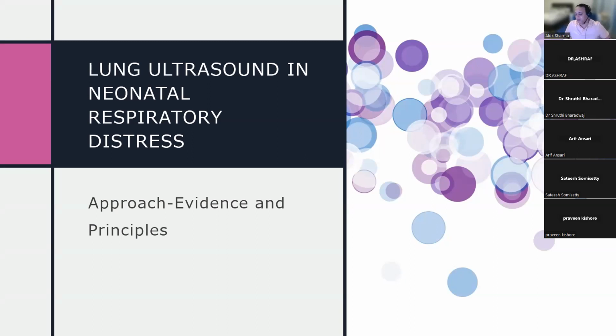On the other hand, if you are going to keep these babies intubated and ventilated because of those logistical issues, the issues around the appropriate care of these babies, because we need good nursing experience, then really I worry that using lung ultrasound in that context, the scores might not necessarily reflect accurately our ability to give another dose of surfactant, because you've given surfactant the first time around, you're repeating a lung ultrasound at 12 hours, but this baby is clinically much better.